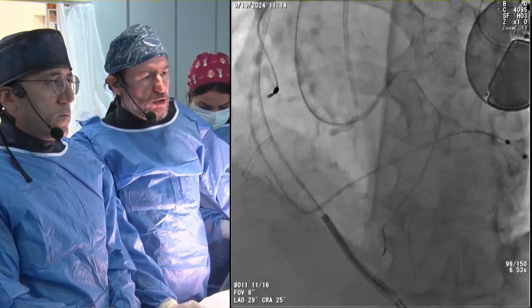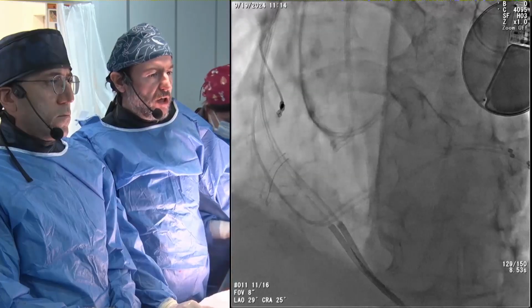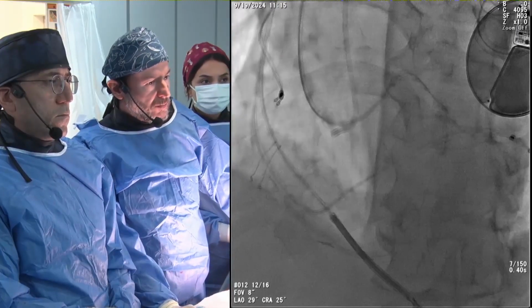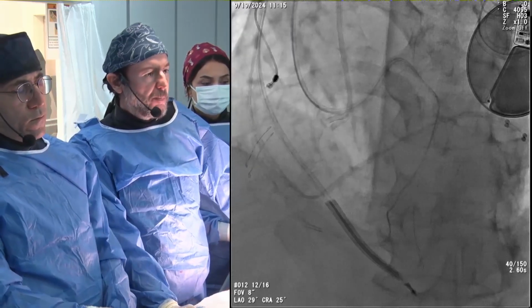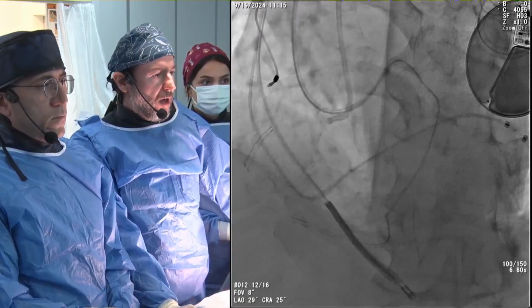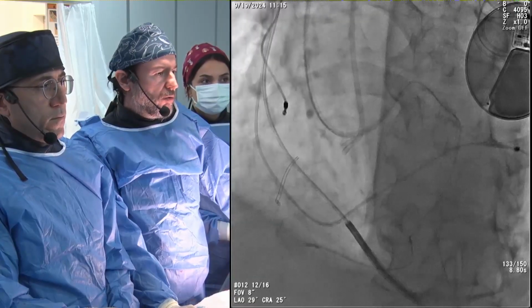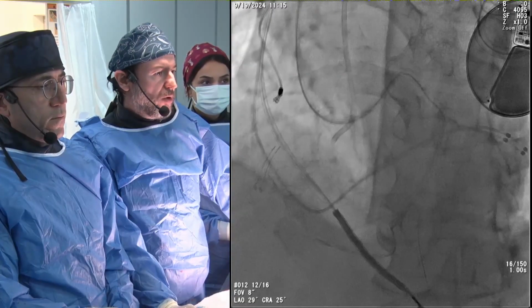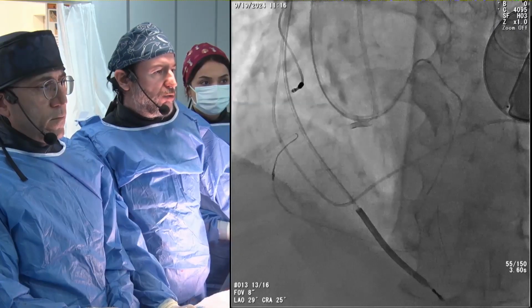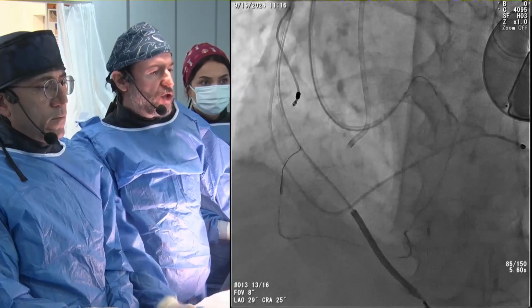And you see this curve here, we had to torque a little bit and then it goes up very easily. Next one. So it was not a challenging septal, I can admit that. And here we go retro into the RCA. Next one, please. And then we got into the distal cap and made a tip injection. Next one, please.